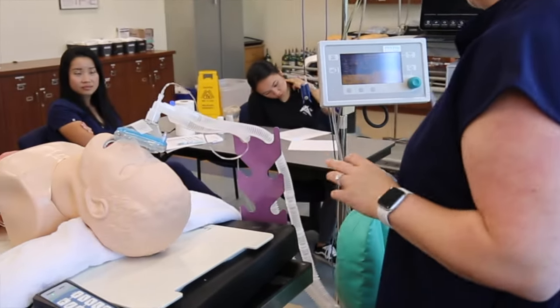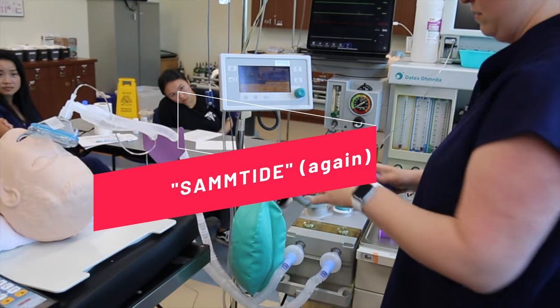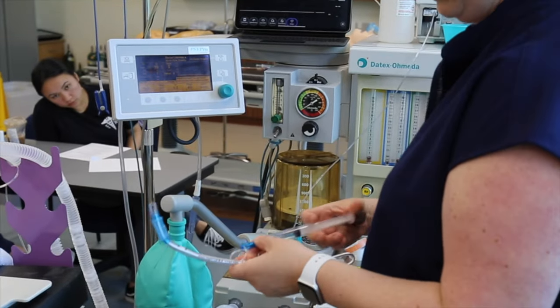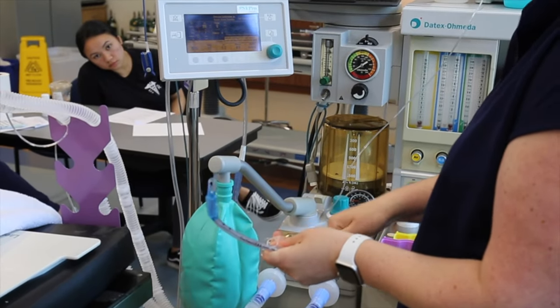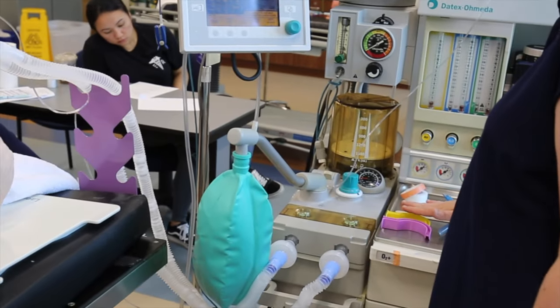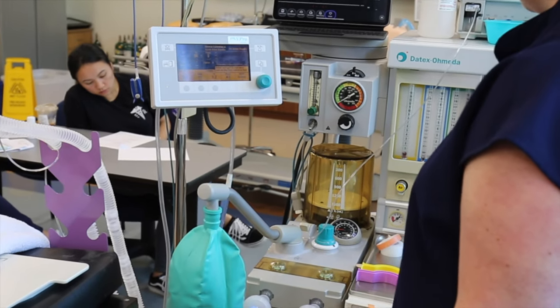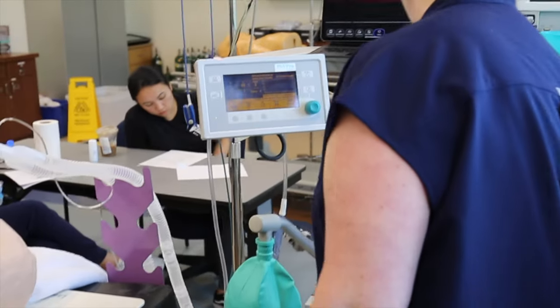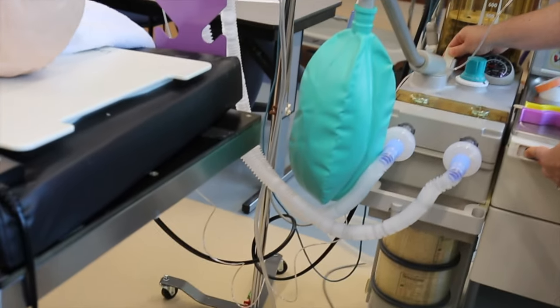So onto SAMMTIDE. So again, I have a working suction. I have my airway equipment, my laryngoscope light works. I have my ET tube. The balloon holds pressure. I have two oral airways, a size 90 and 100, and I have my tongue blade. My machine is on, my flows are off, my vaporizers are off, APL is open, I'm in bag mode. I do also like to have the bellows up. I think it's a good habit to get into.